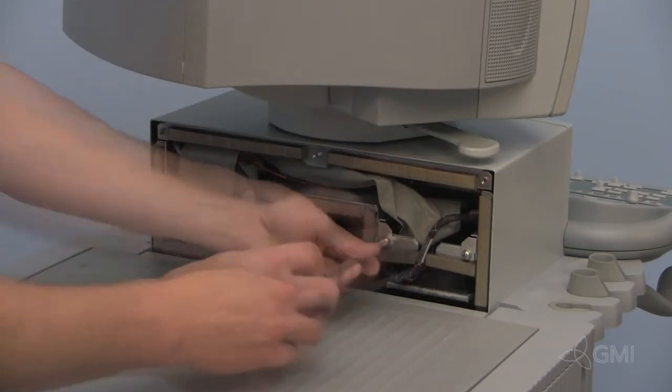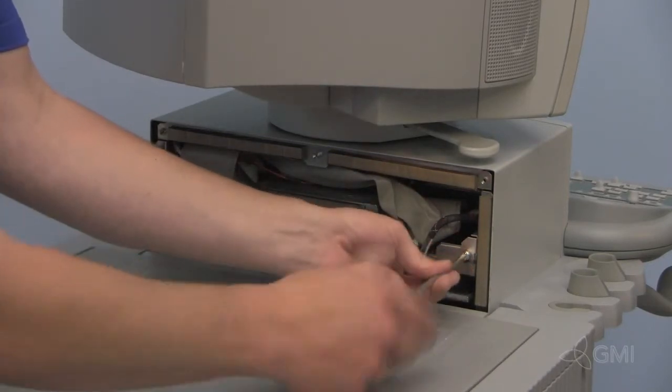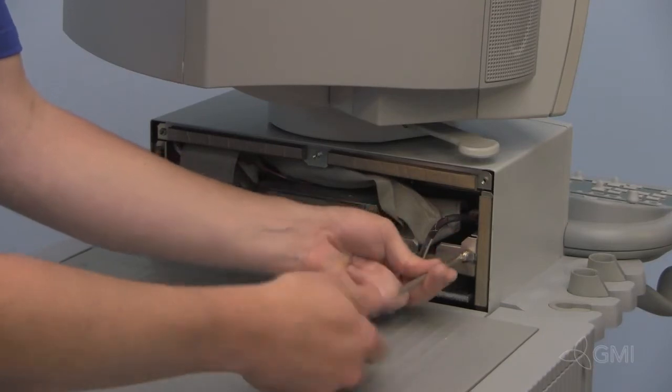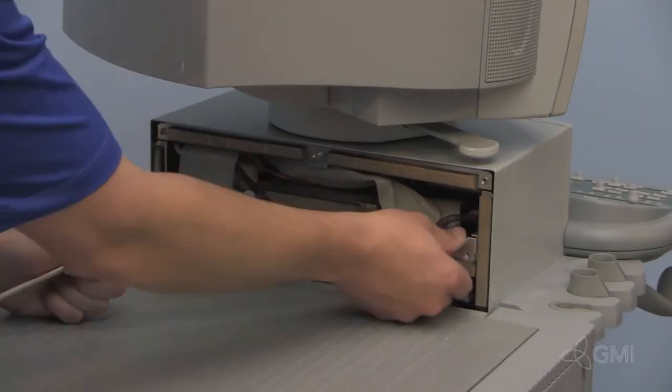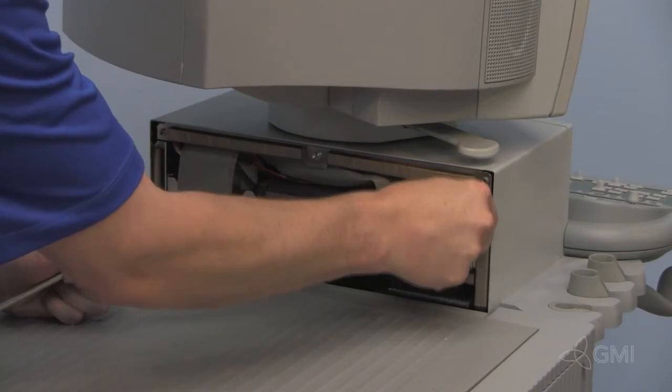Remove the two screws securing the hard drive assembly. Remove the SCSI cable and the power cable.